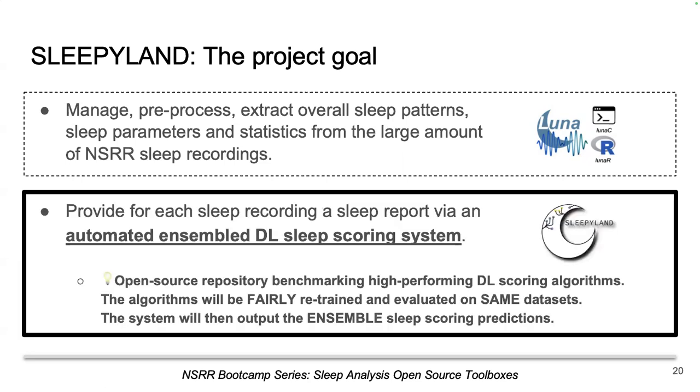What I have to say is that the main goal in SLEEPYLAND is that one. The main goal is to provide, for each sleep recording, a sleep report, but a report that has been generated by different sleep scoring systems, what we call the automated ensemble of deep learning sleep scoring systems.